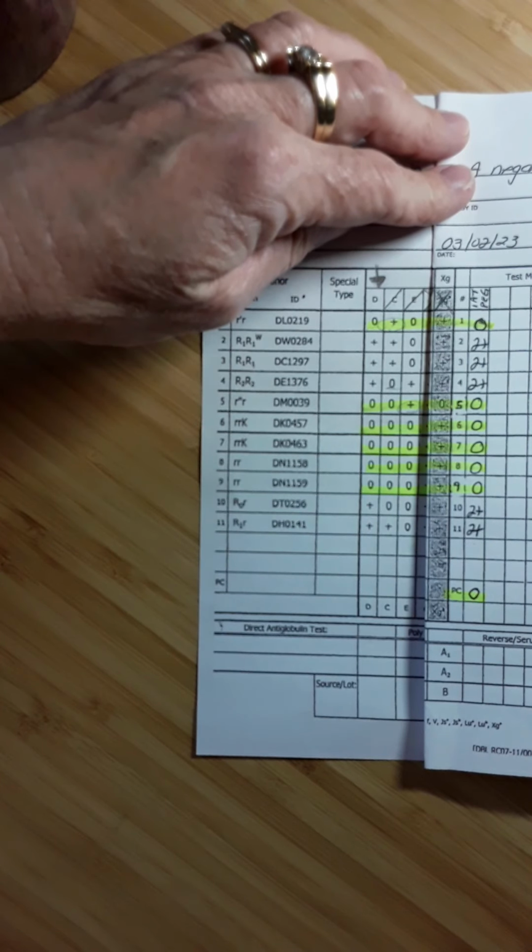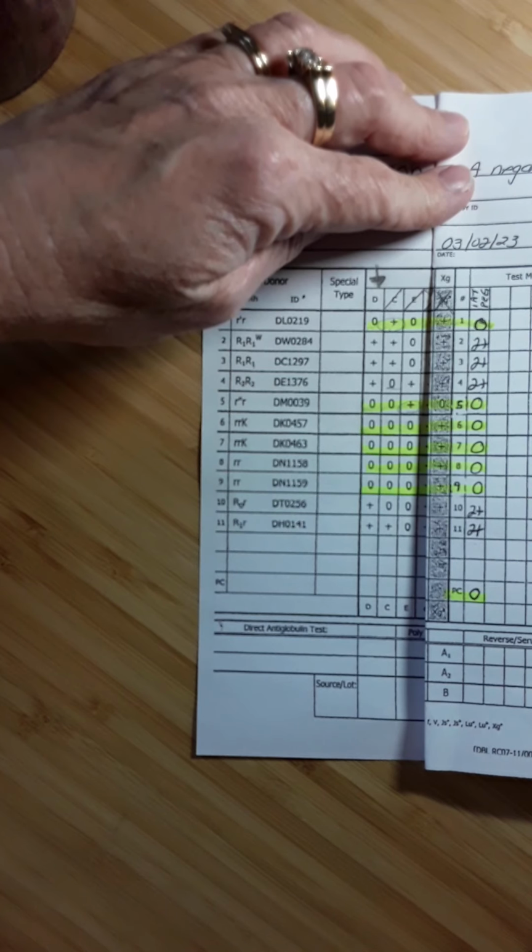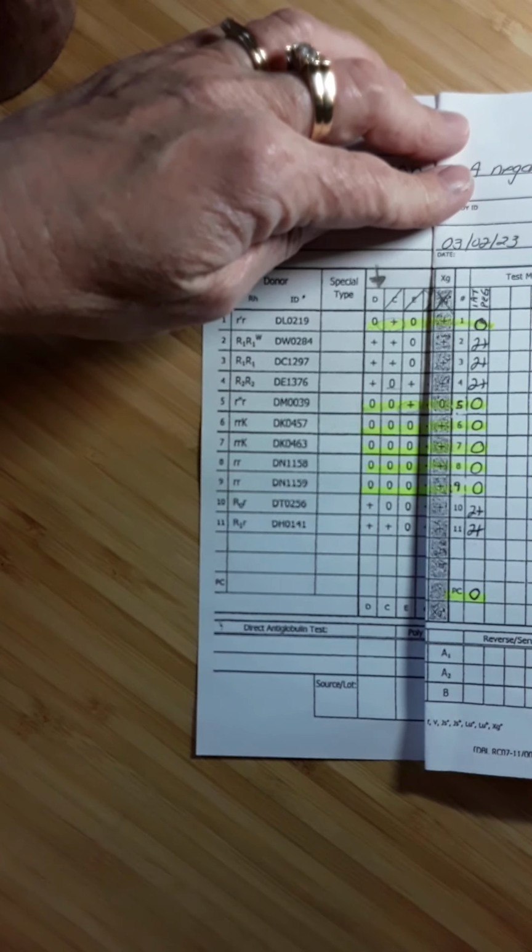Now our next step is step 5 on page 10. And this says set up exclusion cells if required. Well, an exclusion cell is just more panel cells. We ran 11 panel cells, and yet, even with running 11 panel cells, we were not able to completely exclude that the patient's plasma contains anti-big C and anti-big E. So we're going to need to set up more panel cells. Now you're going to have to find a different panel. We've already set up this whole panel and there's no point in setting it up again. So we need to find another panel.